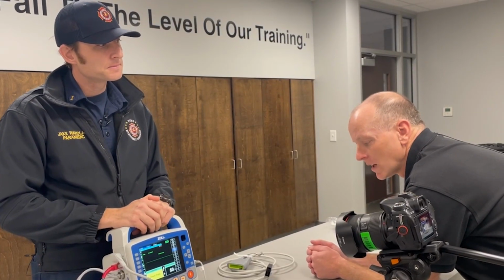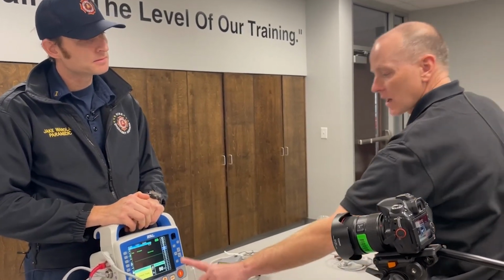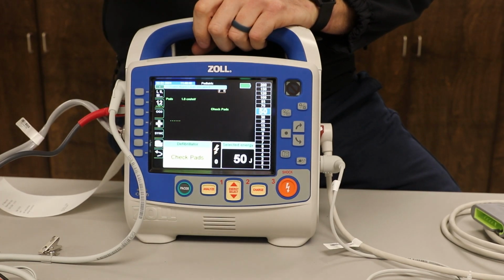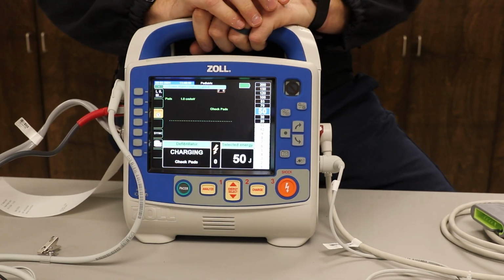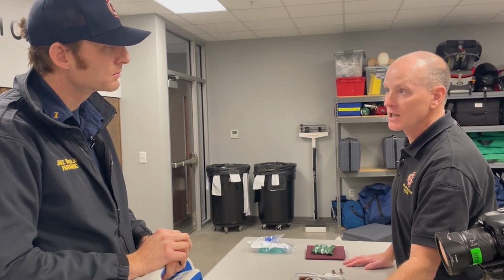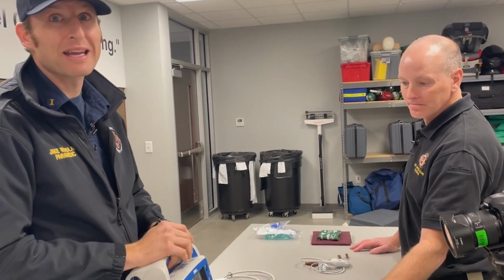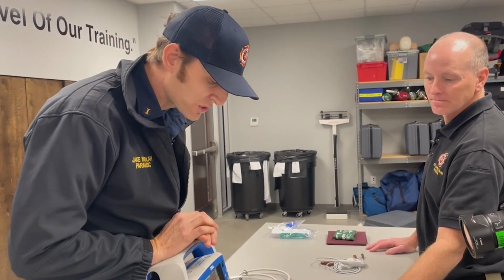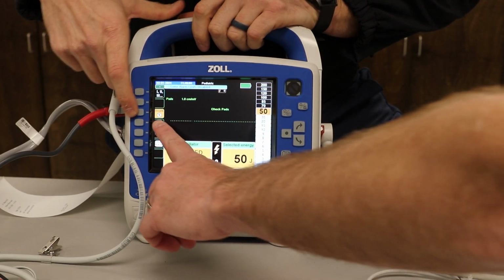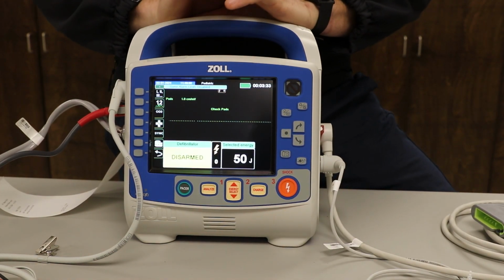Perfect. Let's say that crew on scene decides the AED says, hey, analyze, I need to charge it. Attach pad. So they start charging it. Now what happens if that BLS crew all of a sudden says, oh man, the patient's awake, it was actually a seizure, I don't need to shock, I don't need to discharge it. So there's a couple different ways we can disarm it. One is the obvious again, if we go to these side buttons here, the gray buttons, about 3 buttons down, it says disarm, it's highlighted. Select it, we have now disarmed this monitor.